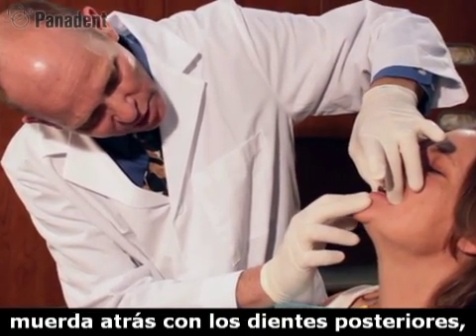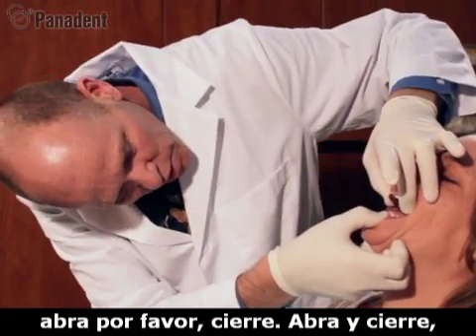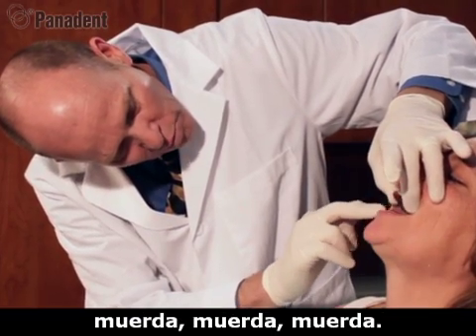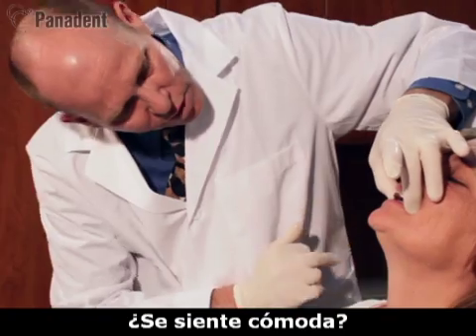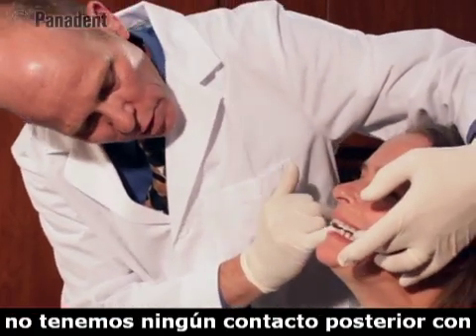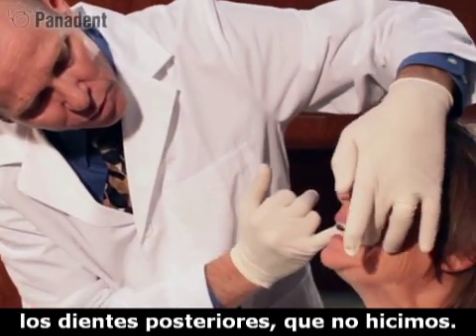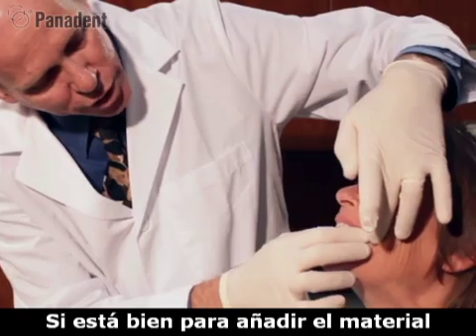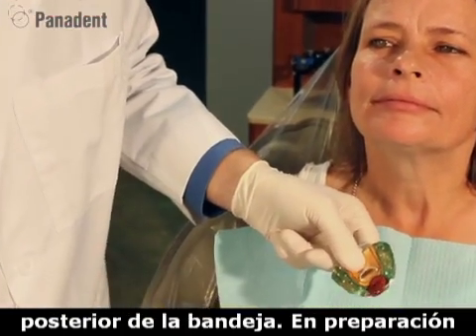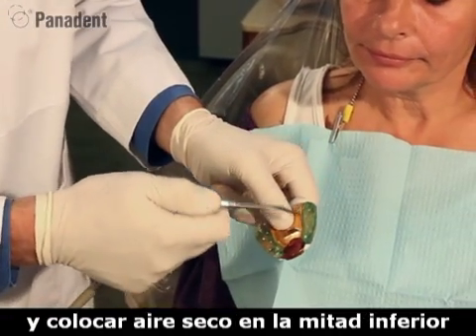Bite back, your back teeth. Open, please. Okay, close up. We go right into that index. Open and close, bite, bite, bite. Does that feel comfortable? Mm-hmm. We want to check to make sure we don't have any contact with the posterior teeth, which we don't. So we're good to go to add the bite registration material to the lower posterior half of the tray. In preparation for that, we'll go ahead and air dry the lower half of the tray.